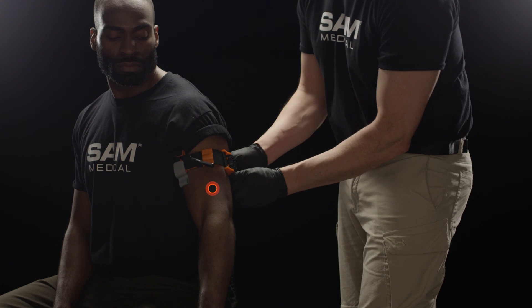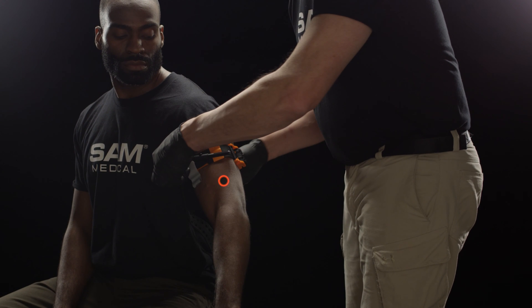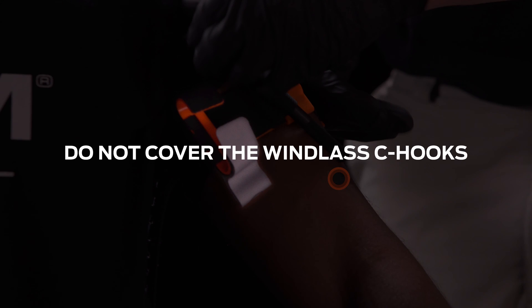Maintaining tension, press the strap back upon itself to attach it in place. Do not cover the windlass C-hook.